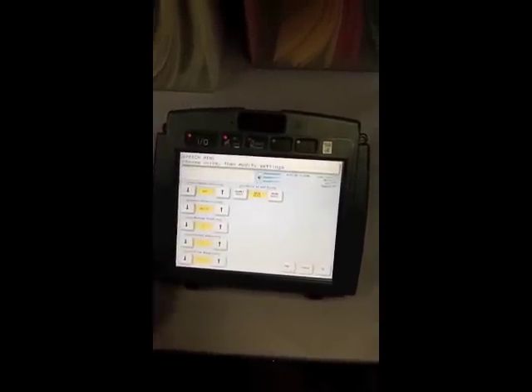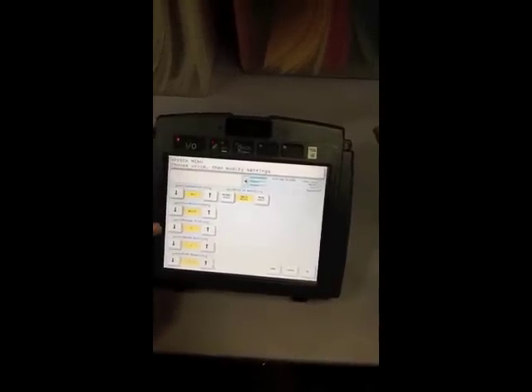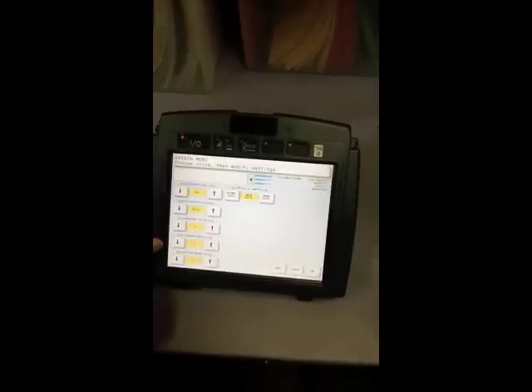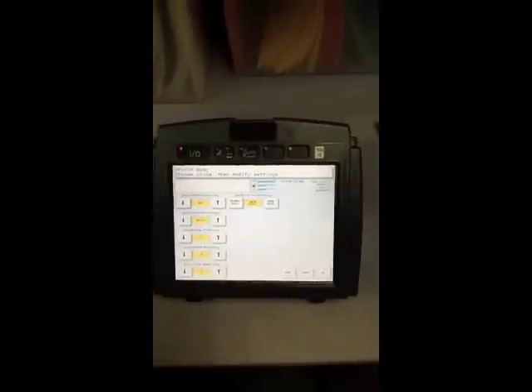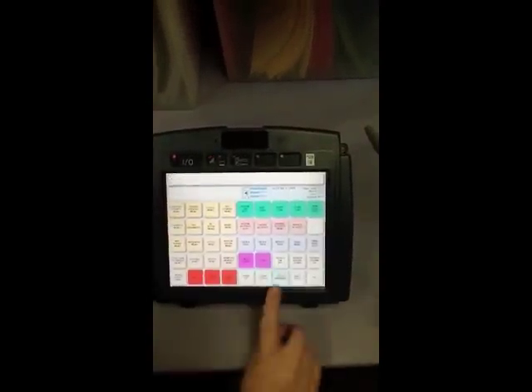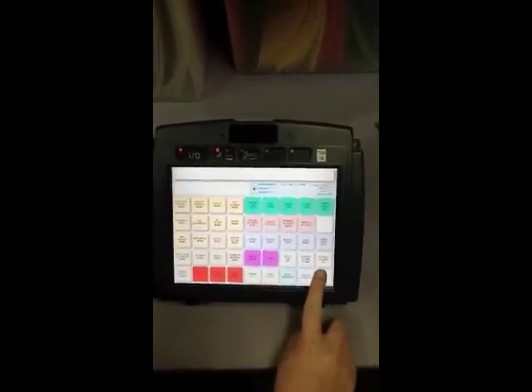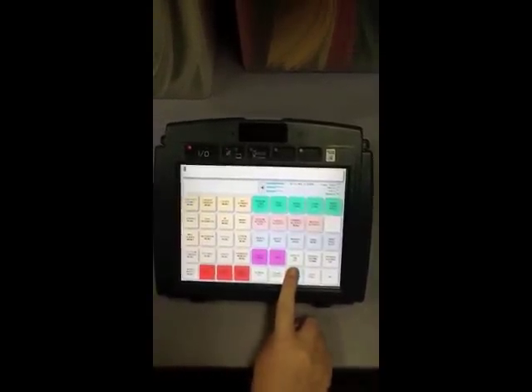Here you can change the synthesizer, the voice, the average pitch, the rate of speech, and the prompt voice and pitch range. To change the loudness, you can do so in the toolbox with the speech volume up and the speech volume down buttons. You also have the option of turning the speech completely off.